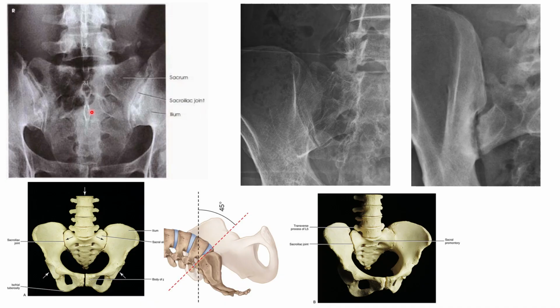So on the sacroiliac joints, we want to make sure that we're not clipping from side to side. So we'll scan our image from side to side and make sure we can see both sacroiliac joints. We want the sacrum and the median sacral crest centered on our image. This image shows the symphysis pubis because of that cephalad angulation of the tube. You can see the symphysis has been superimposed into the most inferior part of our sacrum here, but that's that cephalad angle projecting the symphysis pubis superiorly into that area.